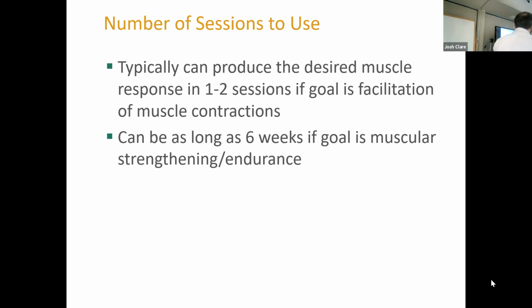So the patients that this would probably be a good indicator for, what manual muscle score do you think? 0 would be the one. Yeah. And as long as that 0 is not because of a complete peripheral nerve injury or spinal cord injury, then this would make sense. Most of the time we see this after surgery. ACL repair is the number one that I see. Could be any surgery though. And there's just this shock that the body's in, where there's an interruption of that neuromuscular signal, where you ask the patient to contract their muscle and they're saying, I'm trying, and it just won't go.